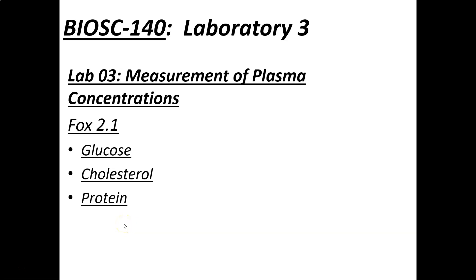This will be laboratory three: measurement of plasma concentrations. The background information and instructions are in FOX 2.1. We will make a few changes to the protocol. What we're going to do is measure glucose, cholesterol, and protein in someone's blood.